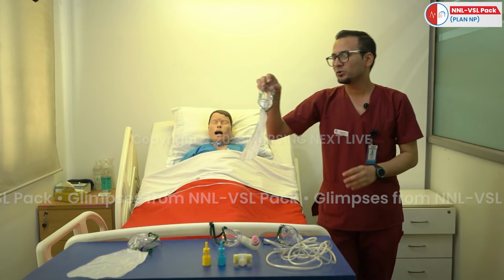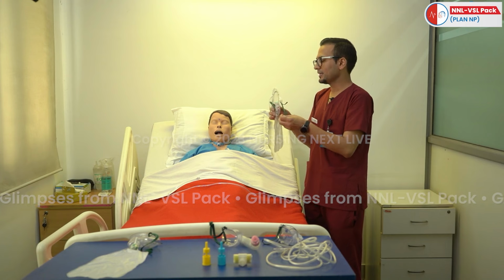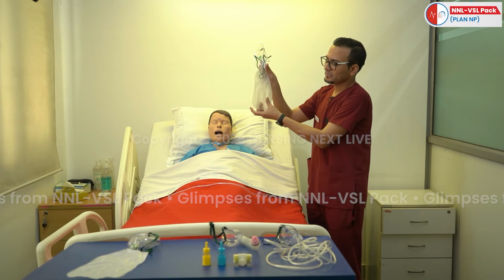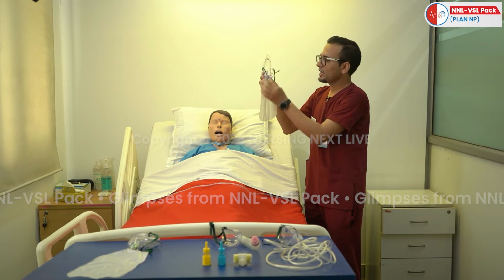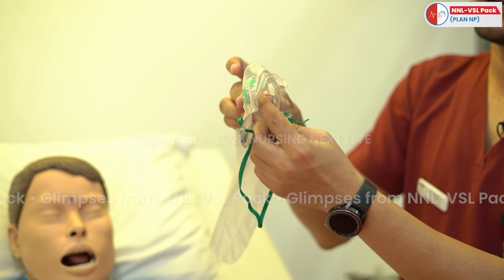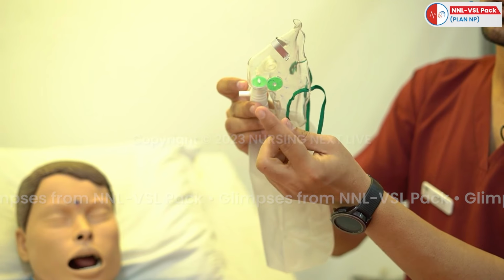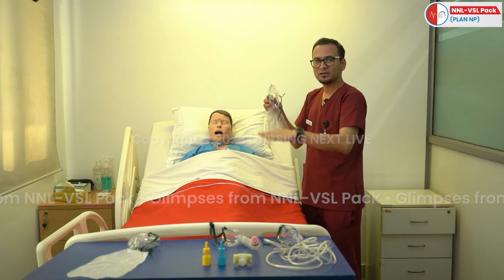Next we are going to show you about the non-rebreather mask. In the non-rebreather mask, the main difference is that you are able to see the reservoir. This reservoir we are going to fill with oxygen, and you can see the flap. This flap is used when the person is able to inhale the air. This flap will remain open, and when the person exhales the air, this flap will remain closed.